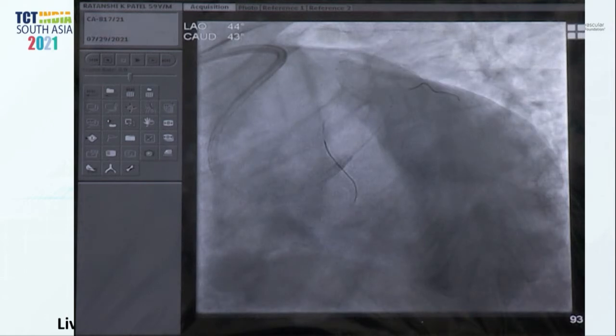Data to go with. Provisional. The provisional is fine, but with two stents technique, you are reaching more towards culotte type compared to TAP or mini TAP.